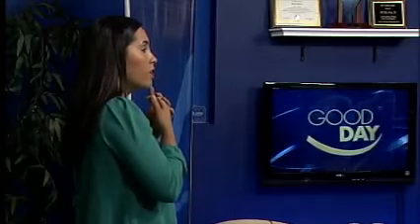Good job. That's great. That's Superman. An O or a C, and then it ends with an N. That's all I could read. You got it. Switch eyes. Oh God, this is... How about now? Here? KZCSK. And here? HGCKO. You know, you've got great vision.